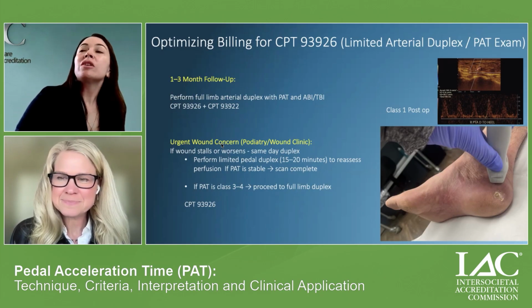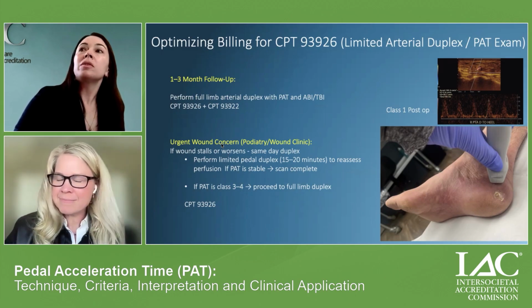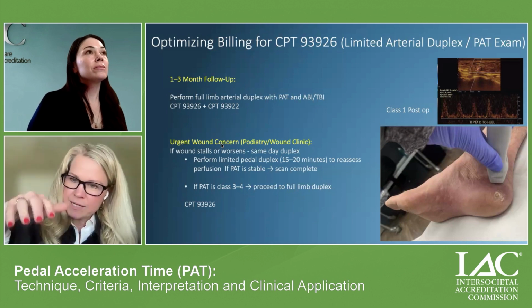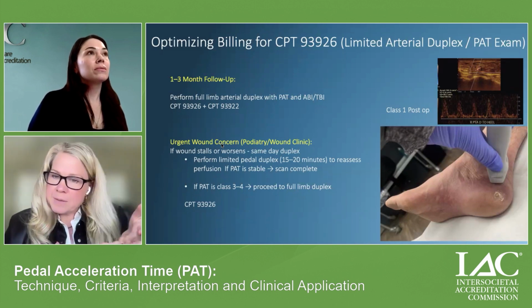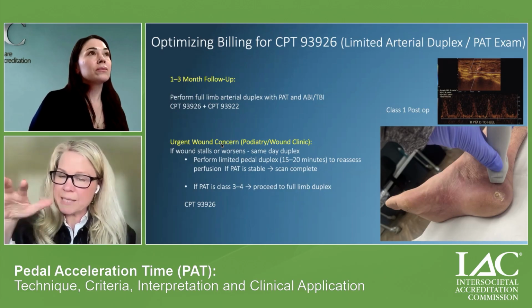Arteries in the foot can be retrograde or antegrade. However, what is the correct direction for the plantar arteries? The arcuate is antegrade towards the toes. That would be antegrade normal flow. And then on the bottom of the foot, antegrade flow towards the toes in the lateral and medial plantar artery.